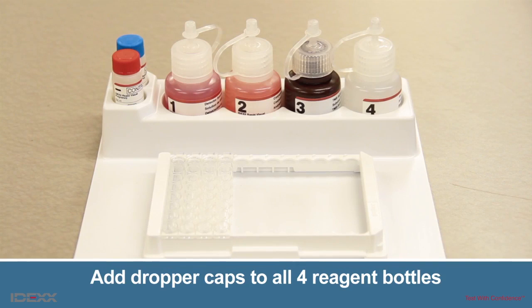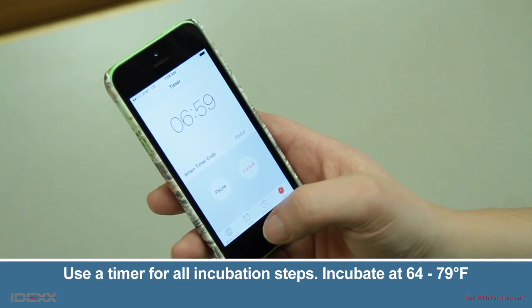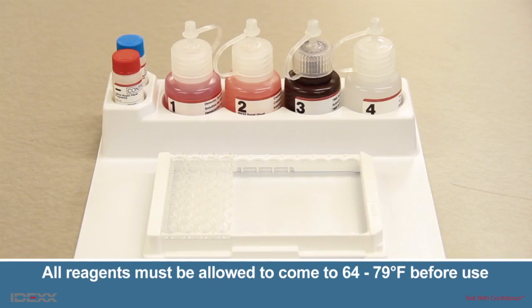Before use, replace the bottle caps used during shipment with a dropper cap. Reagent bottles should be stored with the dropper caps on in the upright position to avoid mixing reagents. Because of the Rapid Protocol, IDEXX recommends users run no more than four strips per testing run. Use a timer for all incubation steps. For optimum results, this assay should be performed at a temperature between 64 and 79 degrees Fahrenheit. Allow all reagents to come to 64 to 79 degrees Fahrenheit before use, and mix reagents by gently inverting or swirling.